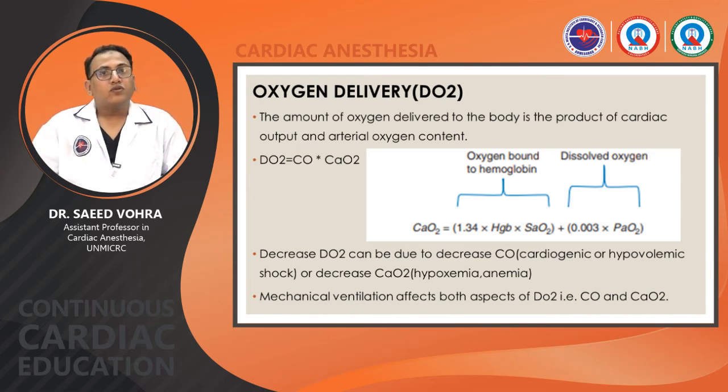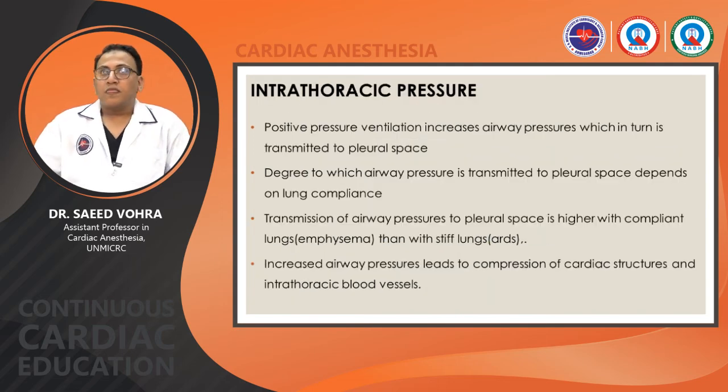Mechanical ventilation affects both the aspects of O2 delivery, that is the cardiac output, as you will see further, and arterial oxygen content by affecting the partial pressure of oxygen in the blood. Now intrathoracic pressure. Positive pressure ventilation increases the airway pressures.